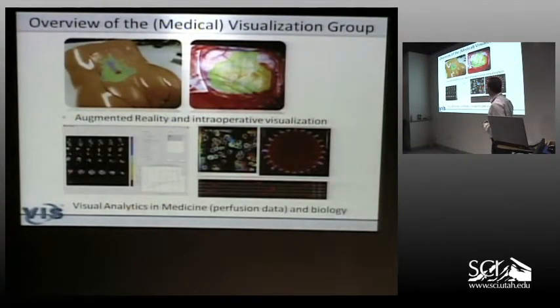Another branch of our work, which started more recently in 2008, was augmented reality and intraoperative visualization. More and more surgeons are interested in having intraoperative support, not only preoperative planning, like a car driver wants to have support in his car. So we came up with a couple of methods to overlay data which we have derived preoperatively during an operation. To be honest, neither this nor that is a patient. This is obviously a phantom, and this is an animal surgery. Yeah? So we are not that yet in the stage where this could be applied to real patients.